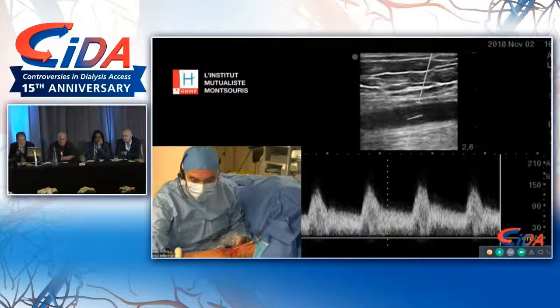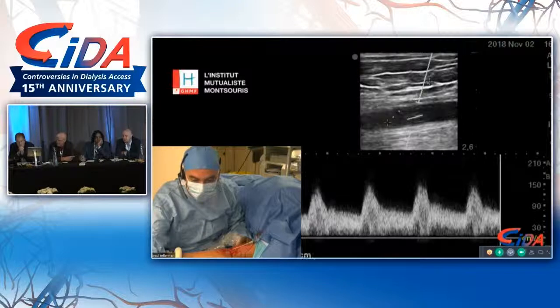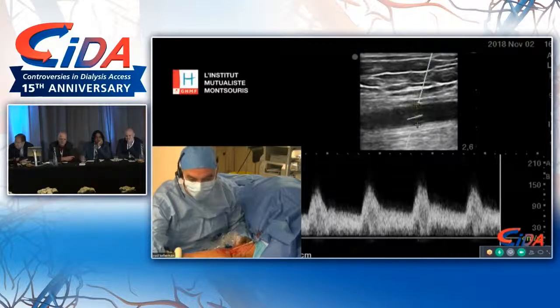He also pioneered the all-in-one maturation. So he had balls of steel and just went up there and ballooned that thing, and he's awesome, and didn't worry about it. When we initially used the balloon, we were just treating spasm. There's always recoil and there's always spasm when you put this device in, and we were just trying to affect that. Like I said, Alex took the technique and the overall results to a new level. So thank you, Alex. That was fantastic.